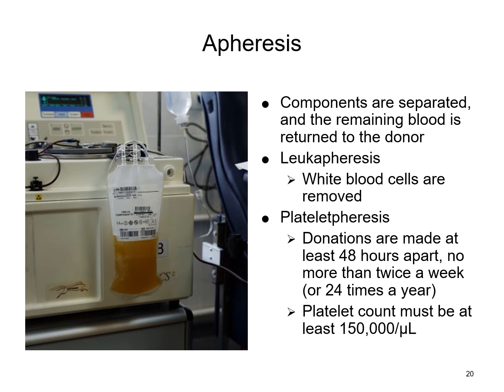You still have to go through the same process of the questionnaires, checking the donor history, and making sure the donor is well. But once you've gone through that process and you're at the point of the donor being collected, the blood, you can see the little tube in here, runs into the machine. Once it's inside that machine, it kind of centrifuges it and mixes it with some saline type stuff, and a few other things in there.